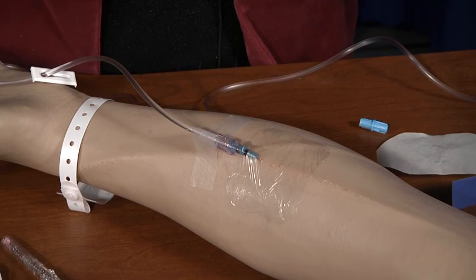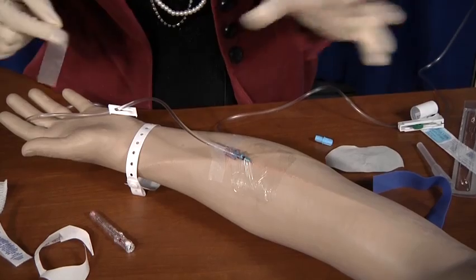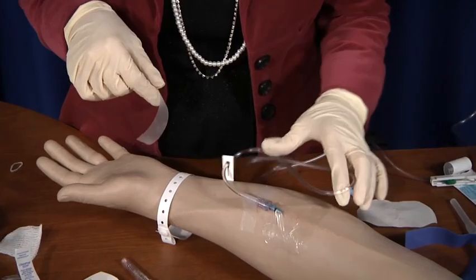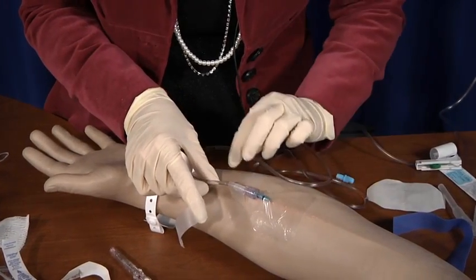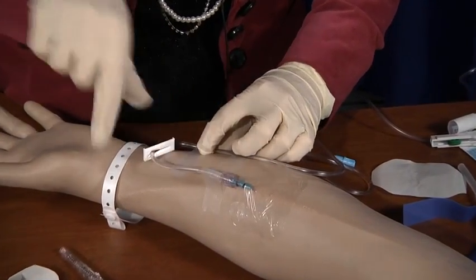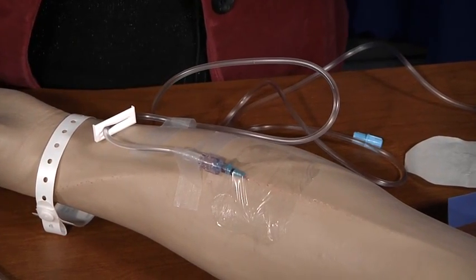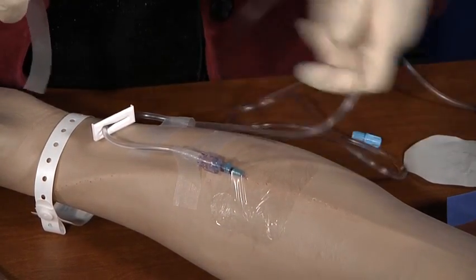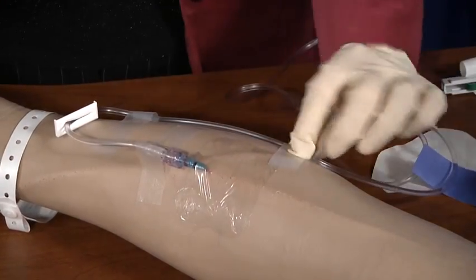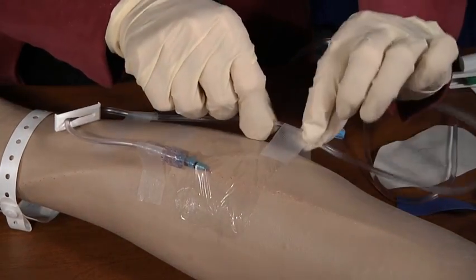Now this securing the line is the most important thing, minus you not getting your patient infected by contaminating the ends. This is the second most important part, because if you don't secure it well enough, they're going to pull it out and you'll have to start over again. So we like to put a loop down here. And if they're not allergic to tape, then use some tape. Then you want to put another piece of tape up here. Now, if he should pull the line, he's got to get through a couple of places before we actually pull the line out, and that's what we want.